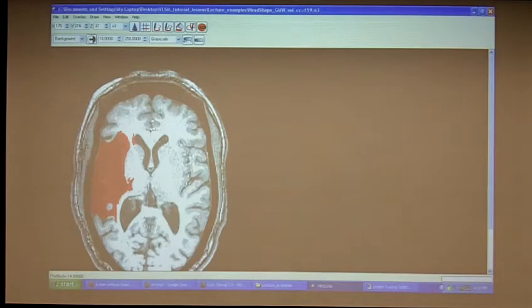It's hard. It's really hard. They really can be. So it's the superior-inferior dimension that is going to matter. It depends on the protocol. The typical protocol that we have used has 160 slices, and we downsample it to 8. Depending on how big their lesion is, and this is a pretty big lesion.